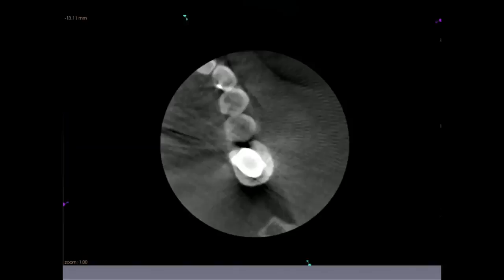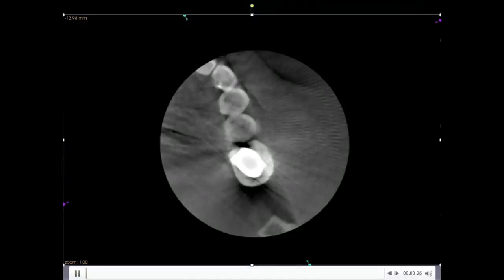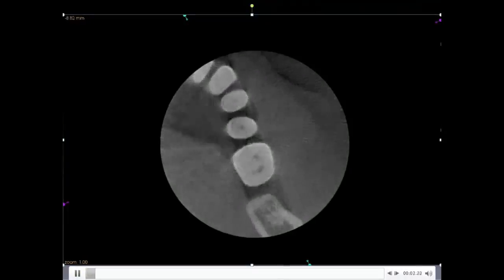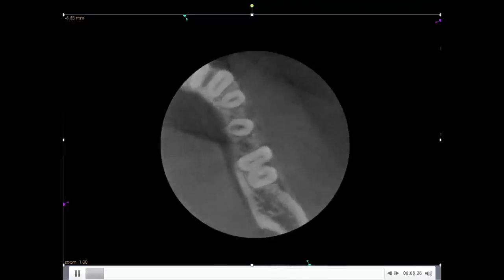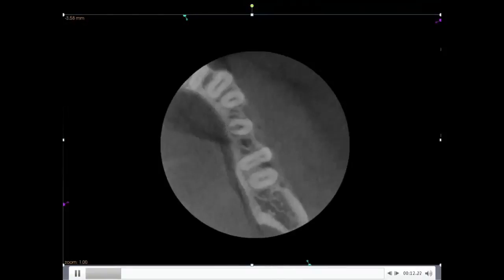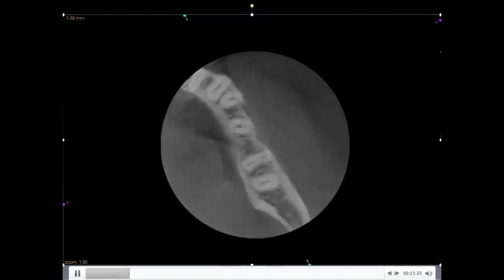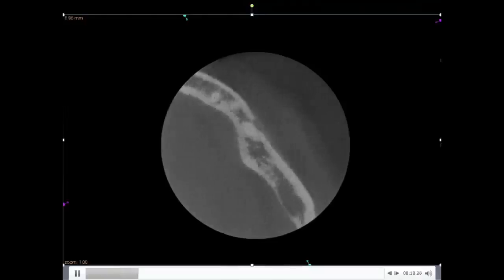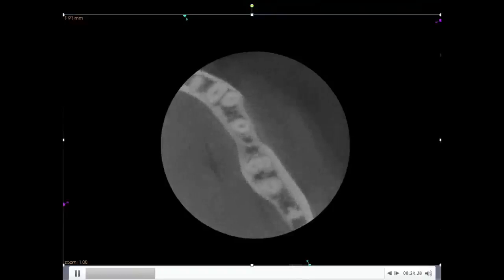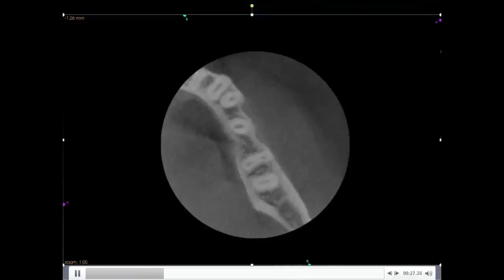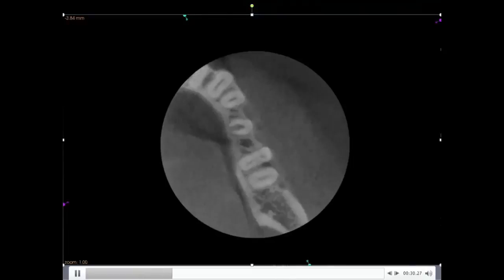As in Shannon Patel's article, with modern-day CT machines we can have a much better look at exactly what's going on. Starting off with our transverse view, as we move down we can see the pulp start to appear. Our lesion initially looks like it's an internal resorption, but in fact it does look like it is perforating in the cervix. The discerning eye will note that the pulp appears darker, and we'll also see an area of predentin protein surrounding the pulp chamber. That lets us know that this is, in fact, a cervical resorption, and would also explain why he is asymptomatic in terms of pulpal testing.